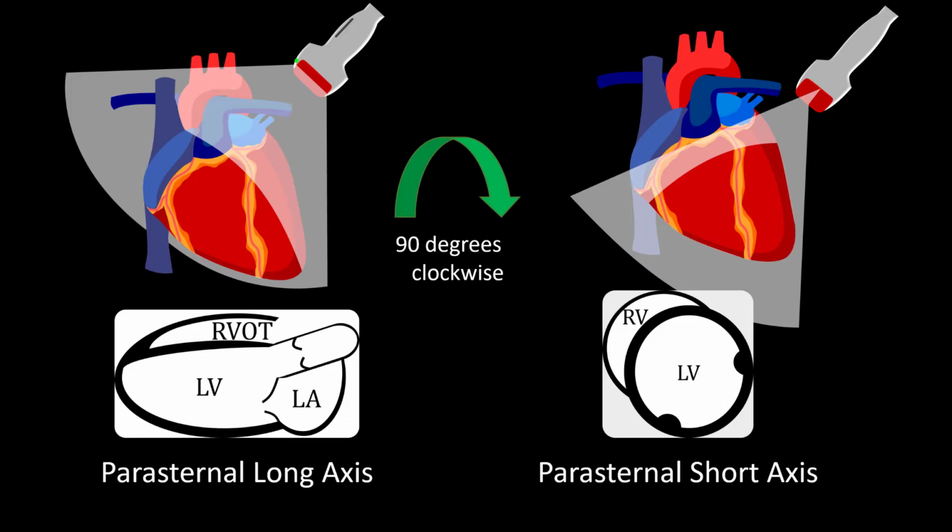One trick to find the best intercostal space is to start pretty high, under the clavicle, and progressively scan every intercostal space down. Once you have one with a view, go one further to check if the lower one is better. I can't tell you how many times I've struggled with one intercostal space while the view is optimal slightly lower.